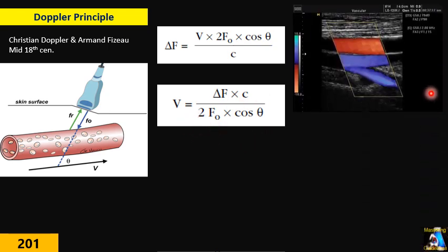One way is with color. Here we have color Doppler. In color Doppler, we have a color bar scale, and the machine tells you that if the moving object that I am screening and detecting moves toward the transducer or against the sound wave direction, I show it positive, here up of the zero, here is baseline zero. If it goes above the zero, we call it positive shift. And in this display it is showing blue.